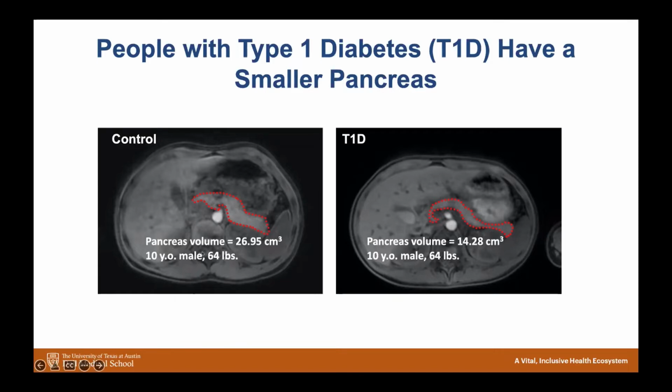The bottom of the image is the spine. You can see the liver over here, on the left-hand quadrant. You can see this individual's stomach. You can see this 10-year-old boy just had lunch here. Here's his stomach, and it's mostly filled with food. He's laying on his back, so it's settling down at the bottom of his stomach. Here's his empty stomach. We're really interested in this bright looking organ right here.